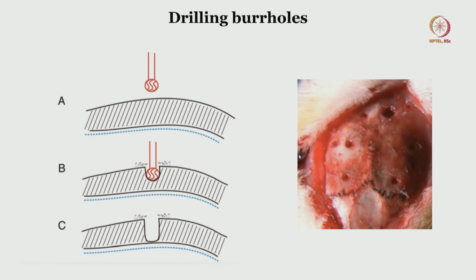You can even use a needle to puncture the papery inner table. If it is thin enough, you can even break it with the needle, but never puncture it or plunge it with force, because that is going to damage your cortical targets, which is very detrimental, and you will probably have to abandon the experiment if there is a plunge of the drill inside the brain.